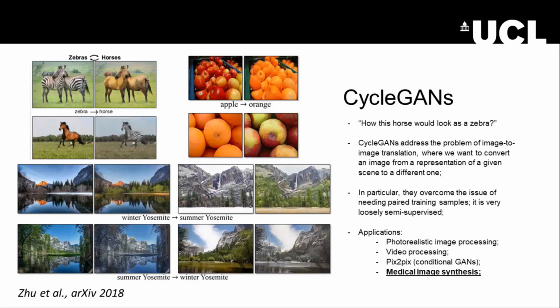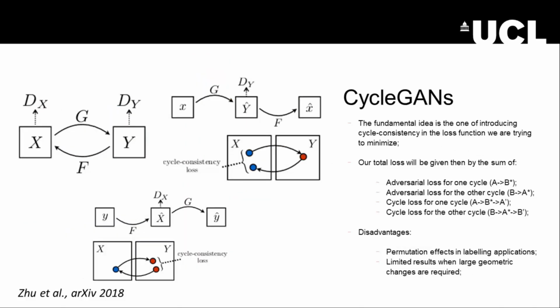It's a method that has been already used in medical imaging, mostly for synthesizing CT from MRI and vice versa. As probably you will know, the variation from the vanilla GANs is that now you have two discriminators and two generators, and at each epoch you are training all of them. So what you want to do is to train first a generator from domain A to domain B, let's say, since we will talk about it, from MRI to histology.